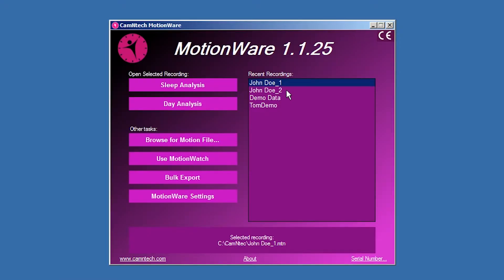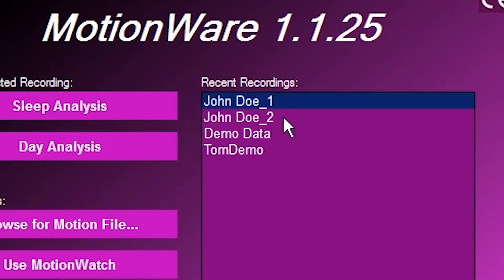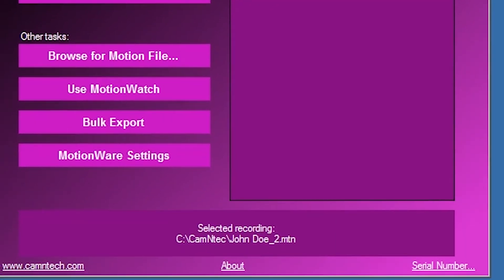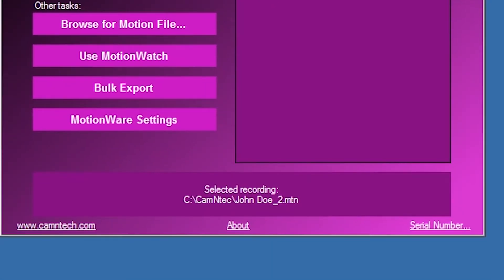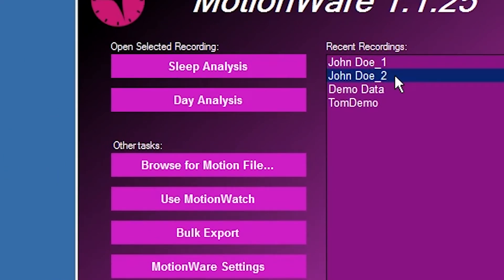When data is saved following download, the file automatically appears in the Recent Recordings list on the front screen of the software. The Recent Recordings list provides a quick access method to the most recently opened or downloaded files. Click once on a file in the list to select it; more details of the file are displayed in the information pane below. The file can be opened after selection by clicking on the Open Selected Recording button. Alternatively, double-clicking on the file will open it directly.